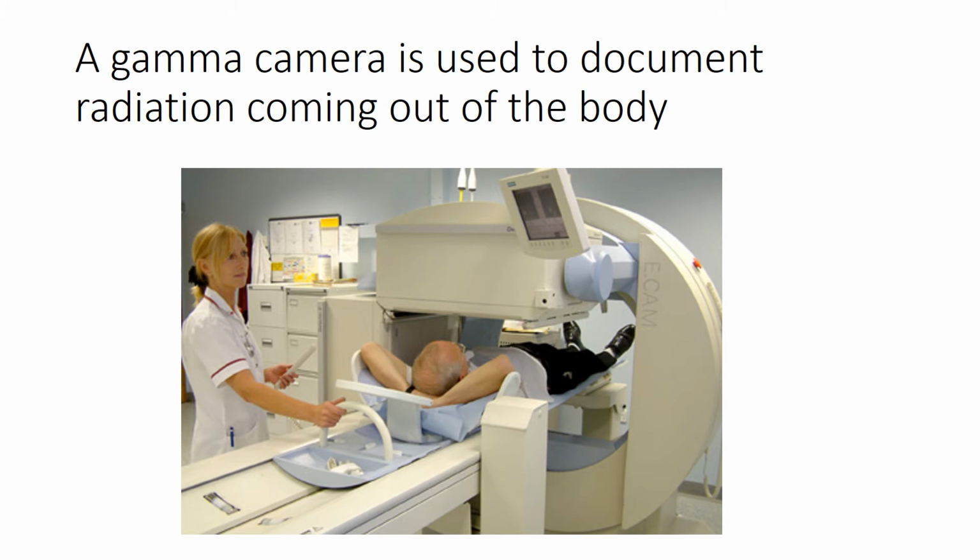Okay, so here's a gamma camera. This is one head of the gamma camera. There's a big crystal in here that detects these radiating waves that come out of the patient. The technologist will move this camera down to just above where it's almost touching the patient, and the patient will lie there as we image.